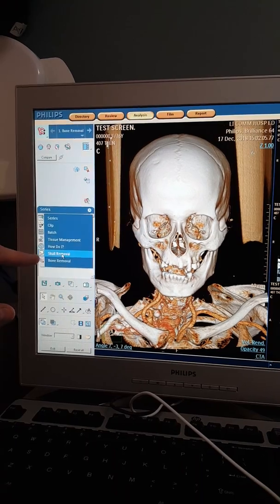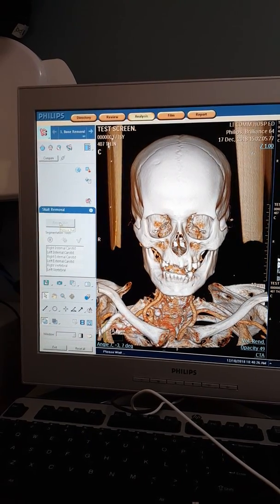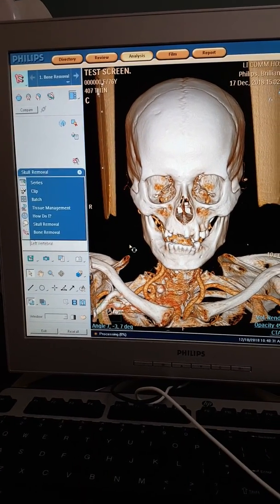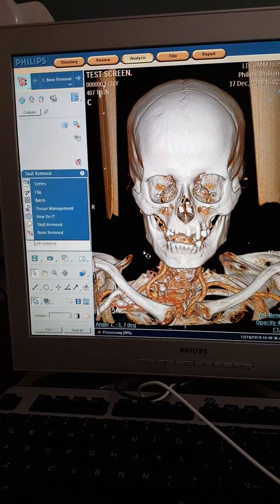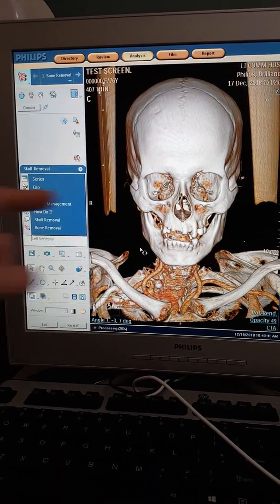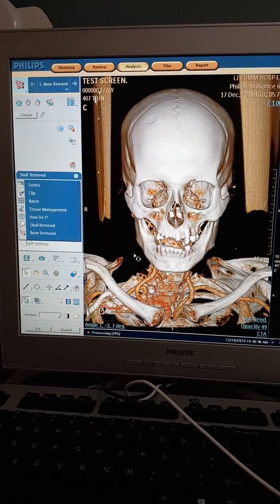We're going to go to skull removal, and because it's a bit finicky, we have to tell it to remove the skull again. Once you click that, it's going to remove the bone — it'll show you 'please wait' at the bottom. It usually takes a little while, getting to about 90–91 percent, and then takes a little break. When it's not visibly progressing, just wait until it finishes.